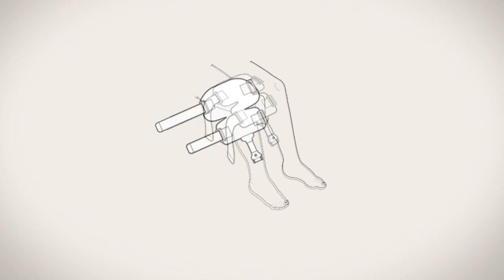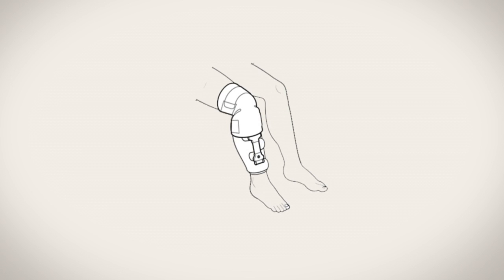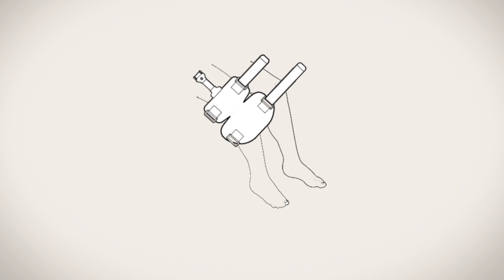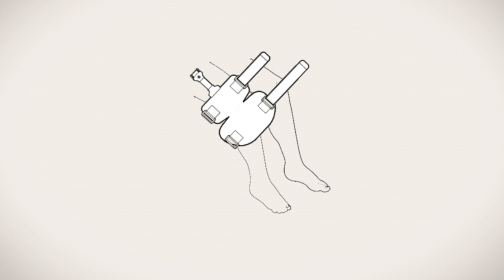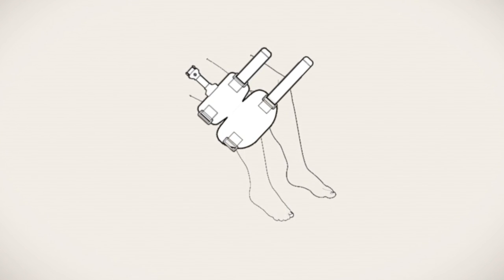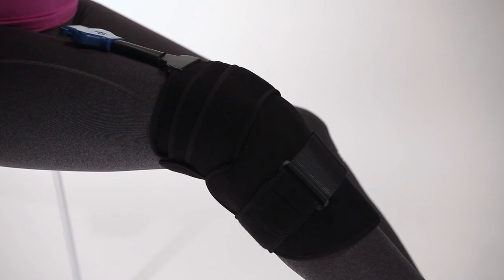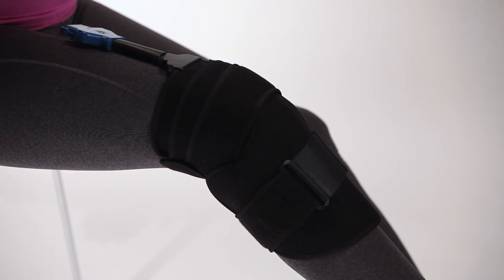Strap the universal pad so it is centered and fits snugly over the knee. The universal pad may be positioned differently on the knee if you want to route the tubing set another way. The pad should be secure but does not have to be overly tight.